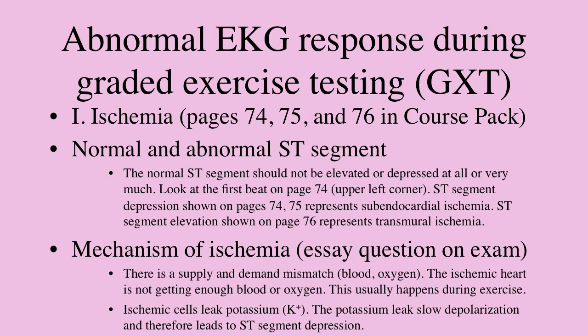We corrected the spasm, and she was okay. So again, the elevation is usually a spasm. It's usually due to transmural ischemia, and it's usually not that common. We won't say a whole lot more about transmural ischemia for this course, but that's a good example of that. We'll be getting back more to the measurement of the subendocardial ischemia in a little bit.